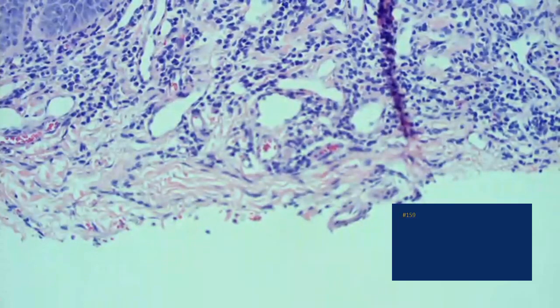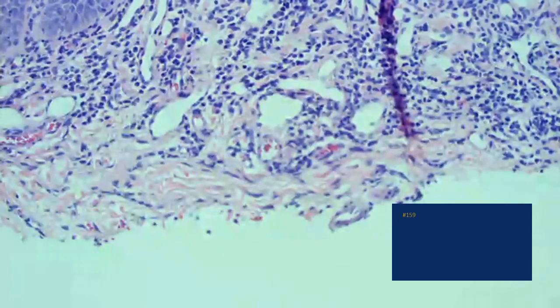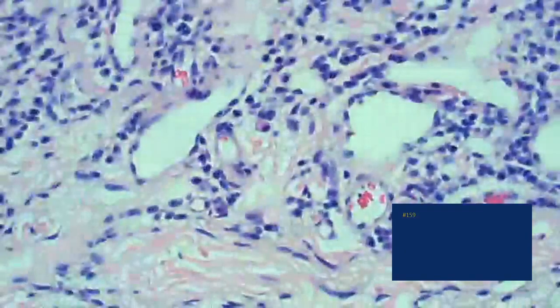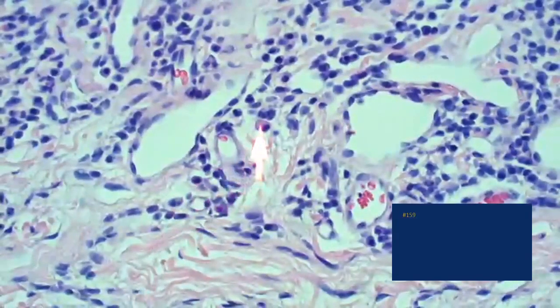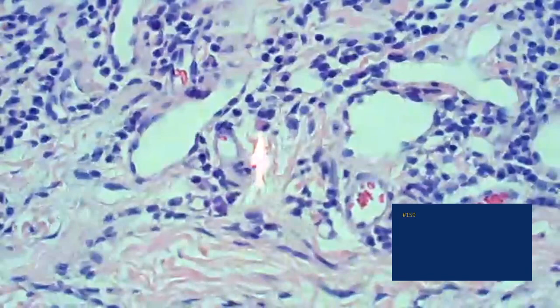Now you can get a squamous cell carcinoma superimposed on infection with candidiasis, so you're not out of the woods if it looks atypical, but just be careful of overcalling it. Notice the inflammatory infiltrate, a lot of plasma cells. You get lots of plasma cells anytime you're on mucous membrane. Russell body, it's immunoglobulin present inside that plasma cell, takes on a pink color.